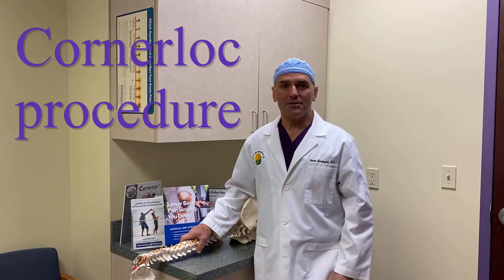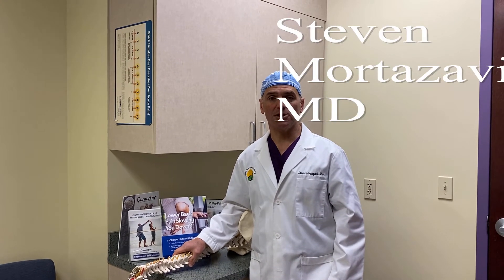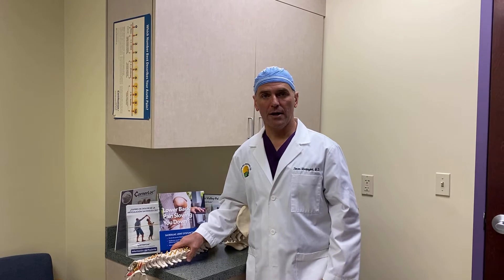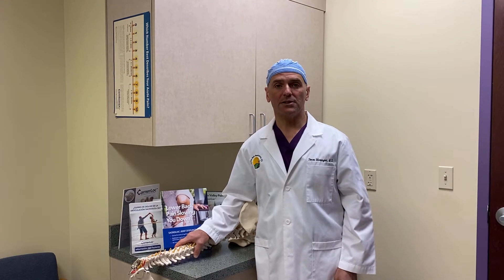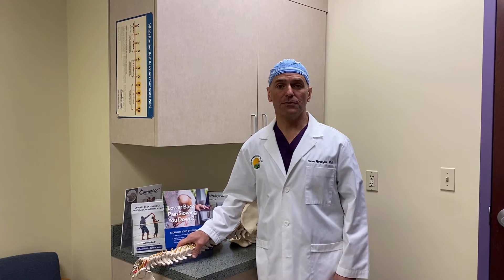Hello everybody, my name is Dr. Steve Mortazavi and we're here at the Office of Valley Pain Specialists in Bethlehem, Pennsylvania. Today we're going to be showing you an informational video on a procedure called Corner Lock. This is a procedure which involves SI or sacroiliac joint fusion or arthrodesis and stabilization, indicated for patients with intractable low back pain related to SI joint pathology, such as patients who've had back surgery and fusion.